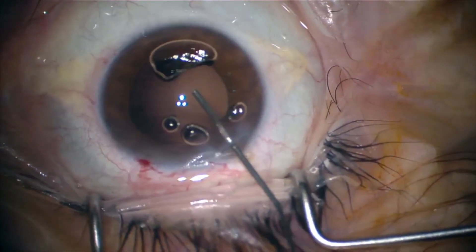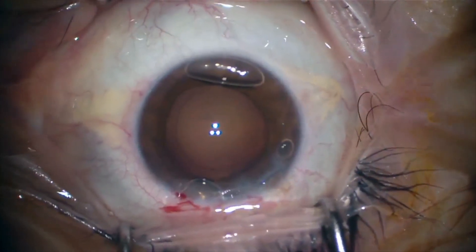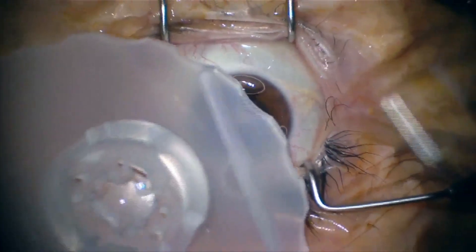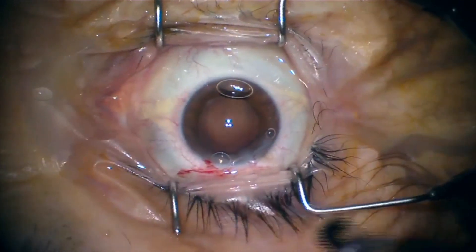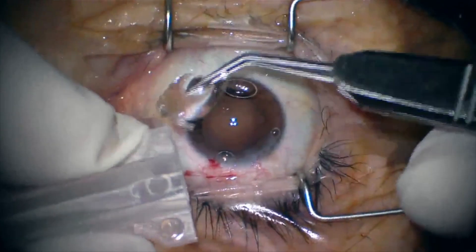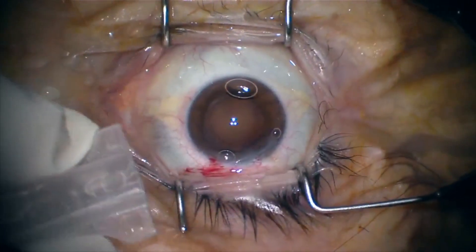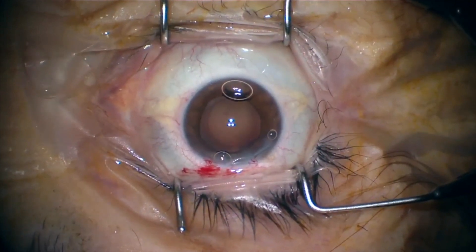Now we place cohesive viscoelastic to form the bag and place the IOL within it. We are using a one-piece natural AcrySof IOL since the patient had hyperopic LASIK prior surgery.